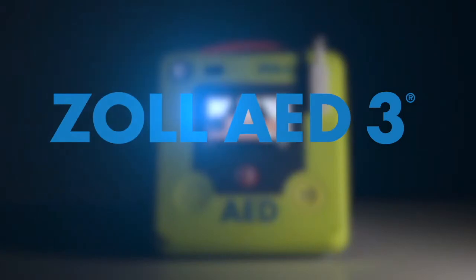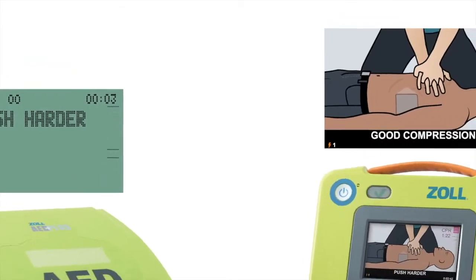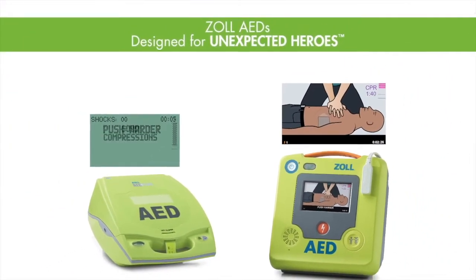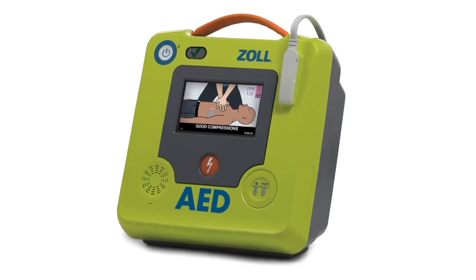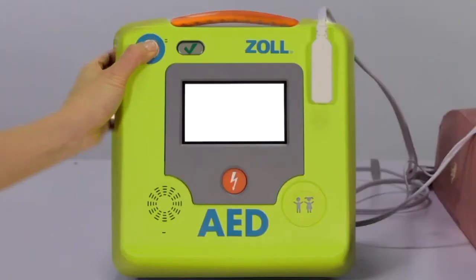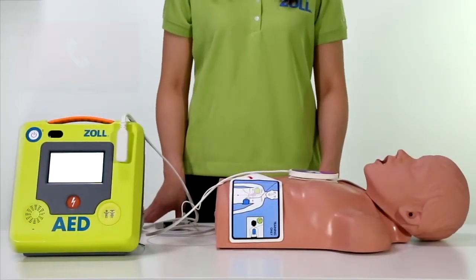The Zoll AED3 — the AED that leads the way. All Zoll AEDs are equipped with real CPR help technology that empowers rescuers with the tools necessary to provide high-quality CPR. We are now going to turn on the Zoll AED3 to demonstrate some of the advanced features as well as show you the power of real CPR help.